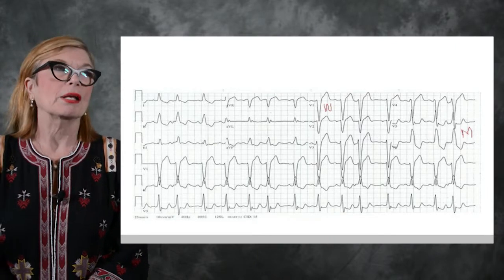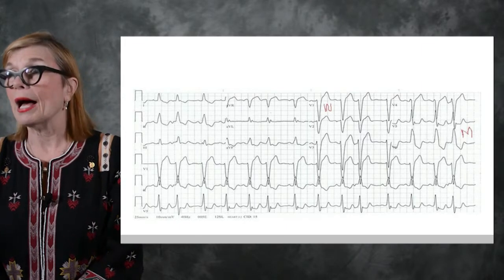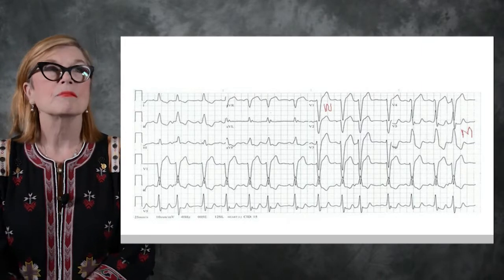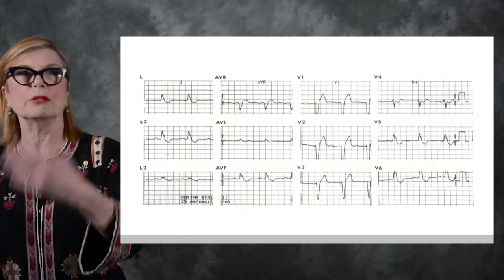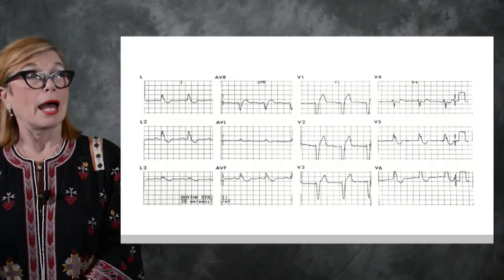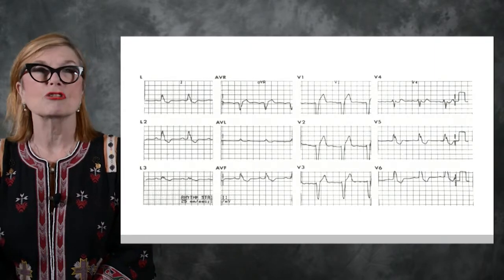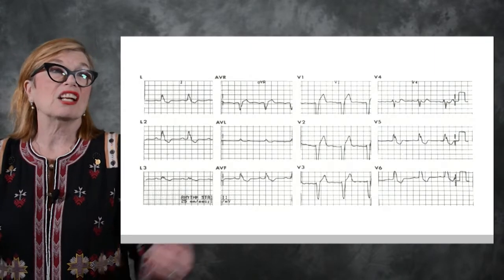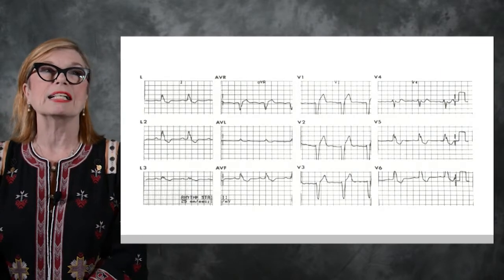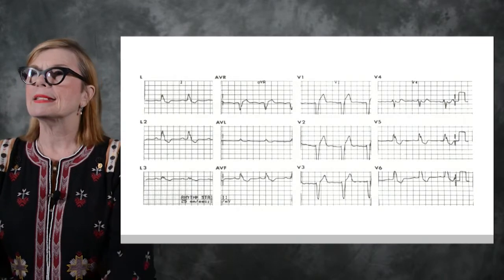He also has something else, and I'm not asking you to diagnose it, but this patient also has left ventricular hypertrophy. So I'm seeing these EKGs, I put them in my program, but I just capture them from somewhere and stick them in there. And I'm like, whoa, that's a really good EKG because that tells you a lot of good information. Now, V1 and V6, I can't even see the top of V6, but I can see that it's upright, and I can see that it's wide, and I can see that the T wave is inverted.